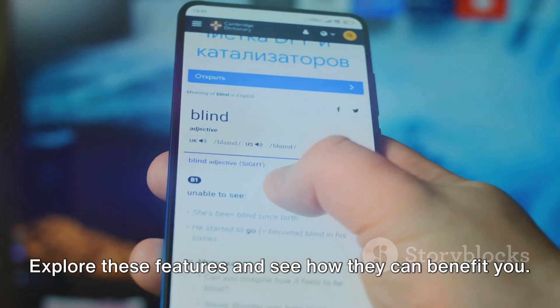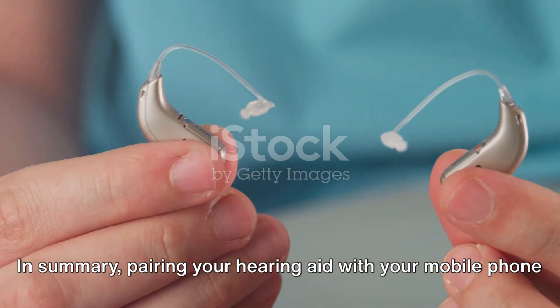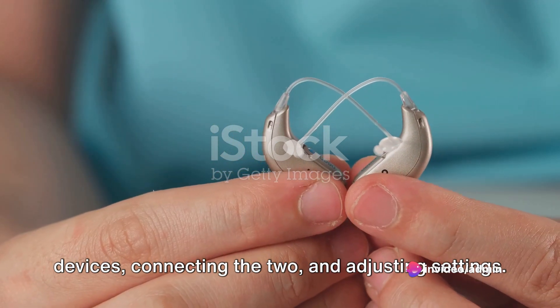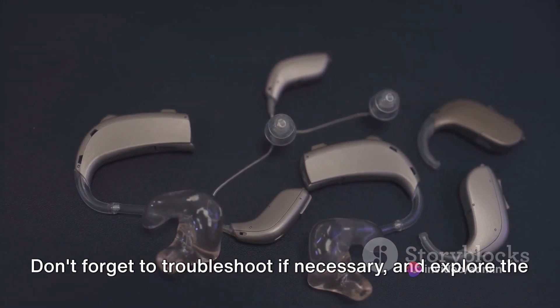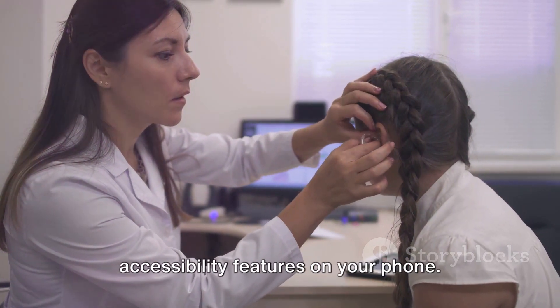In summary, pairing your hearing aid with your mobile phone involves checking compatibility, enabling Bluetooth on both devices, connecting the two, and adjusting settings. Don't forget to troubleshoot if necessary and explore the accessibility features on your phone.